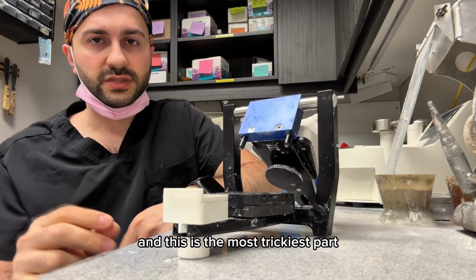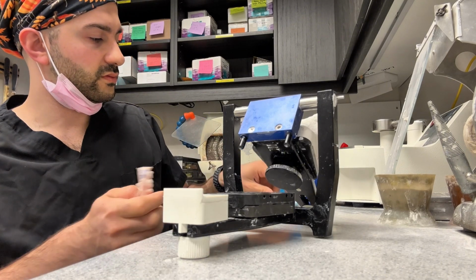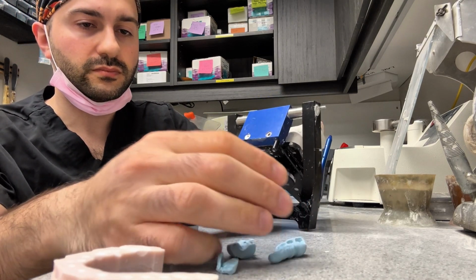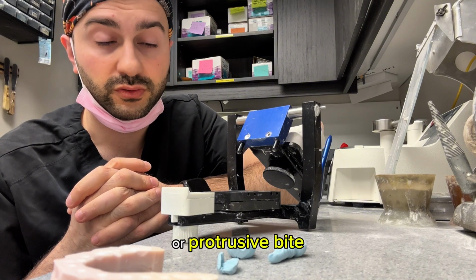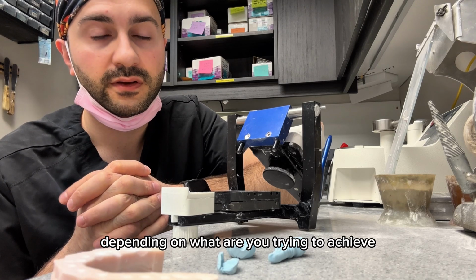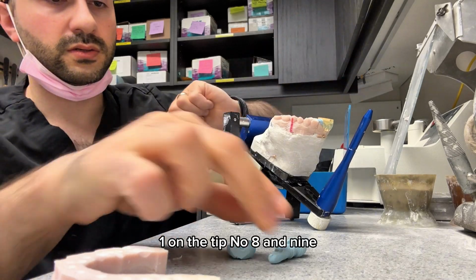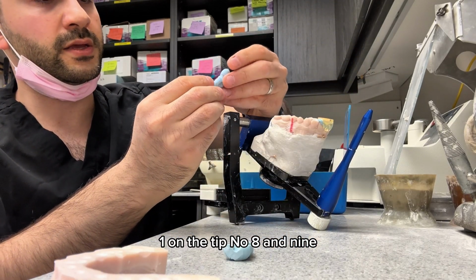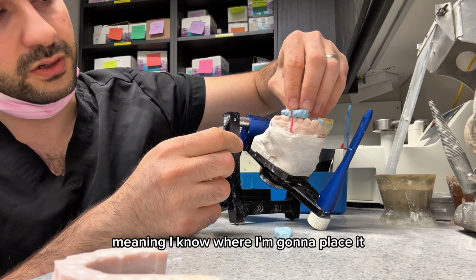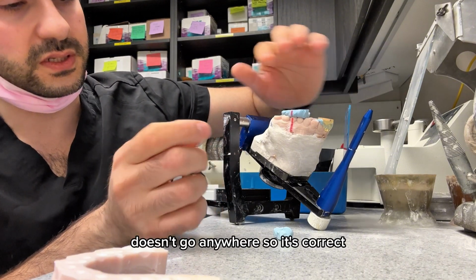And this is the trickiest part, because there are so many things to idealize. So we use for that either the vertical dimension of occlusion or protrusive bite, depending on what you are trying to achieve. I will be using an example of protrusive bite. One on teeth number 8 and 9. I marked this one in red, meaning I know where I'm gonna place it. This is 2. Make sure it's sturdy. It doesn't go anywhere, so it's correct.